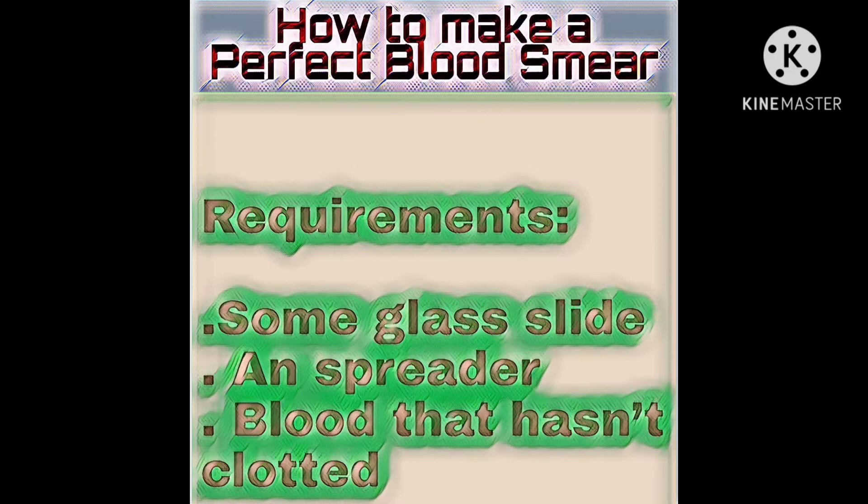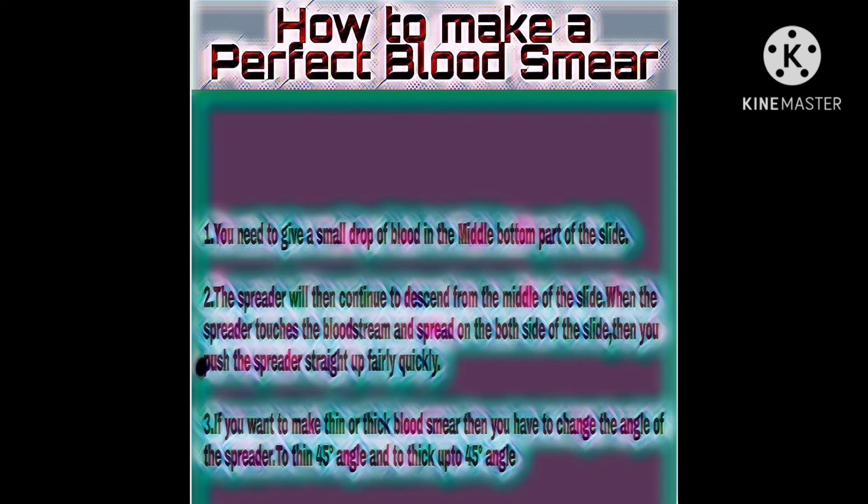This is because if the spreader slide is ordinary glass, or if it is as thin as a glass slide, the blood smear is very likely to be poor. So we will use a special spreader that is heavier than an ordinary slide. I made three steps to make a perfect blood smear.